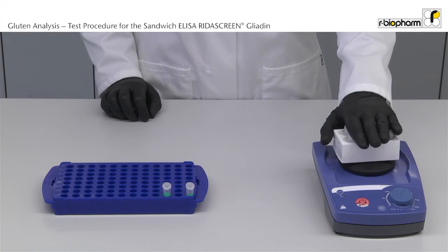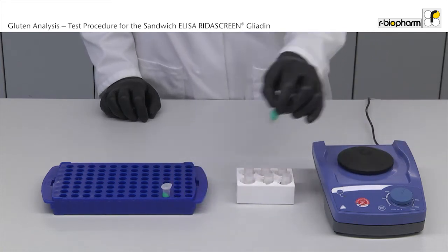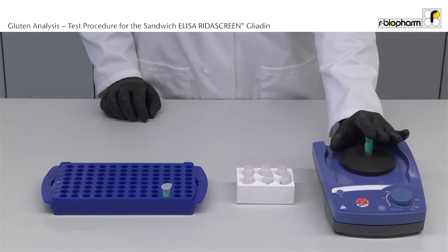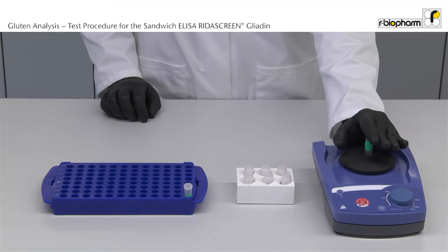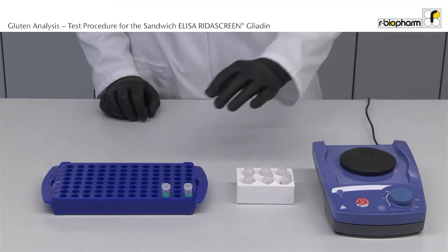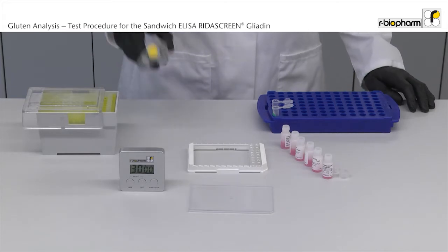Mix the standards and samples before use. Pipette 100 µl sample or standard per well in duplicate.